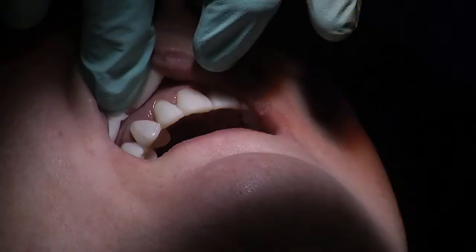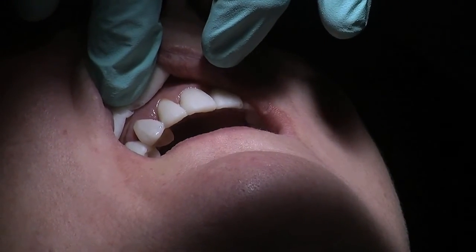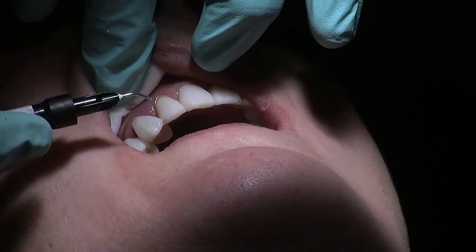Just put that light cure on there for about 10-15 seconds. You don't need any etch or bonding or anything. From my experience, it just sticks to the material and that's it. You don't have any problems of the material coming off, which is also a big advantage. Take it out. Just want to add one other little bit here.